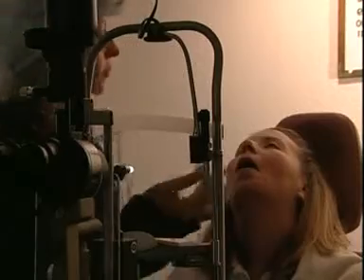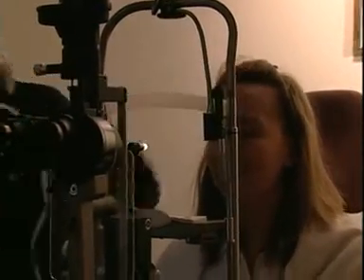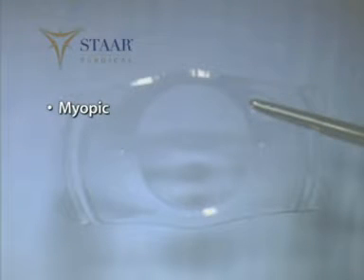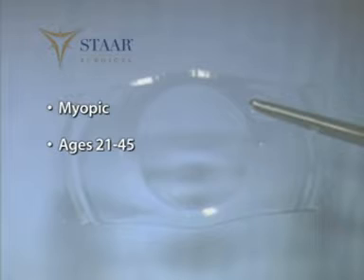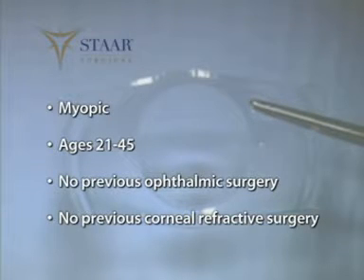A critical step in preoperative planning is the selection of the best candidates, particularly for your first 20 cases. The best initial patients are myopic and between the ages of 21 and 45. They have had no previous ophthalmic surgery and especially no previous corneal refractive surgery.